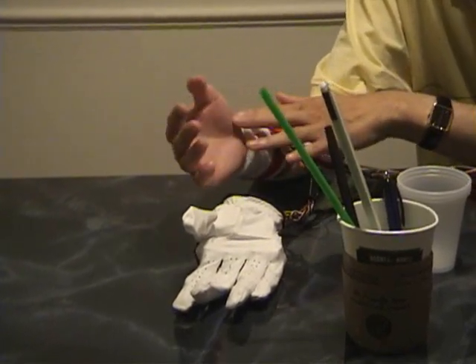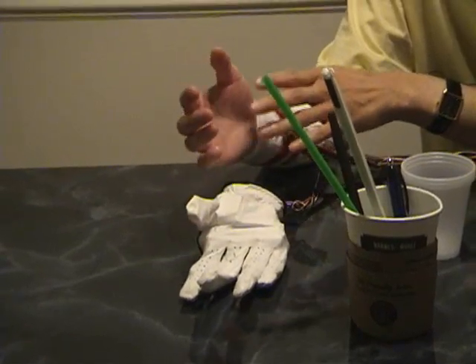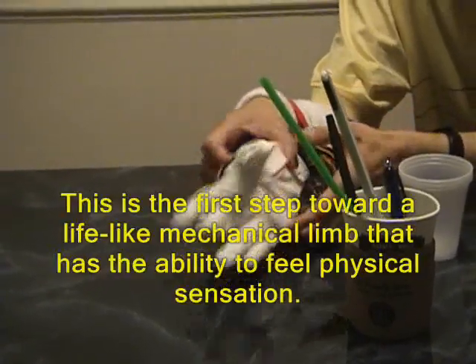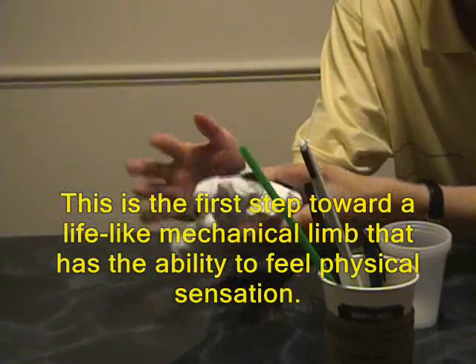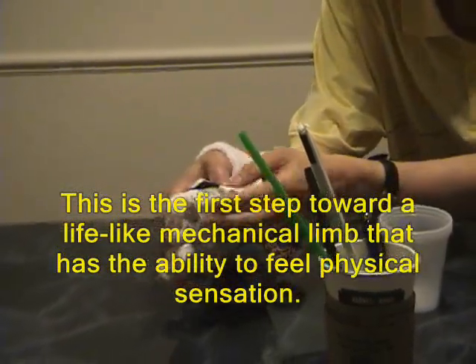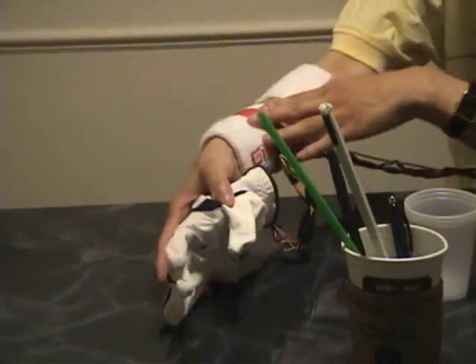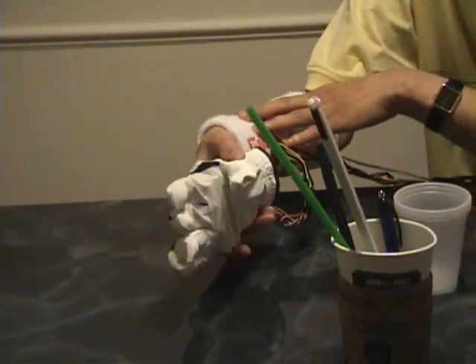It won't be the same as the original hand, but it's better than not having a hand at all. Basically, this hand could function as a feedback tool — there's a sensor in here. So when you actually grip something soft or hard, it can tell you that you're gripping too hard or too soft, and you control it through your muscle. So it also has feedback.